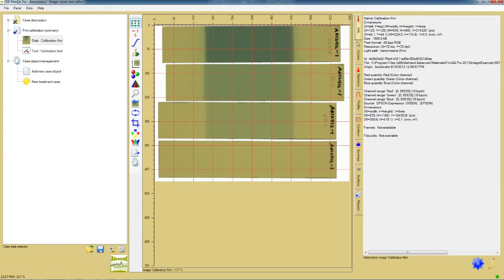One of the most useful fitting functions is expressed as response equals A plus B divided by dose minus C, where A, B, and C are the coefficients to be determined. Responses for each color channel are fitted separately, but since there are only 3 coefficients for each channel, as few as 3 dose points plus the corresponding RGB response values are needed to make the correlation.